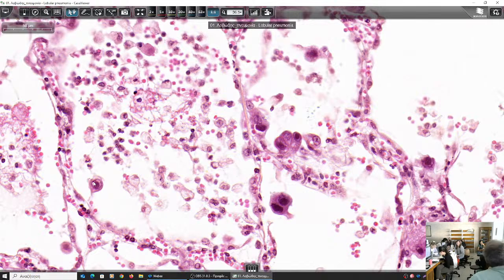Which of the features that we have seen previously is not compatible with a viral pathogenesis of pneumonia? No, that could be. Chronicity could be. Another thing that we saw, that it is not compatible with virus inflammation, but of bacterial inflammation. Remember what we saw? The pus, the abscess. If we have the abscess, Edmund, it's a bacterium. However, we have an additional infectious factor here identified histologically.